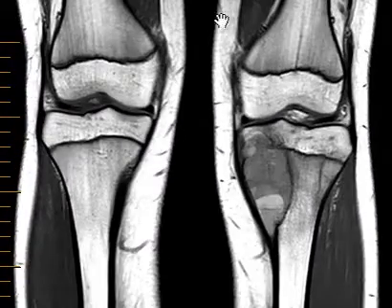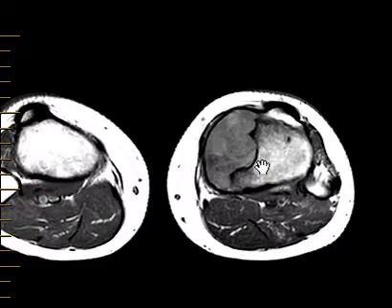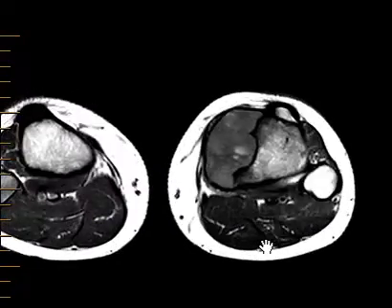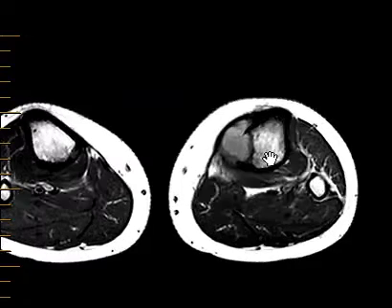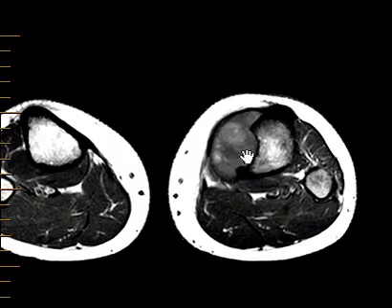Now in the axial images we see that the margins are indeed sharply defined. The margins are dark, which means they're corticated, going along with a non-aggressive type of lesion. There's no soft tissue component, and we can see these areas of foggy brightness — very bright here, which corresponds to hemorrhage. You can also have high proteinaceous material that can cause that, but this is probably hemorrhage. We can also see a fluid-fluid level: bright fluid above, darker fluid below.